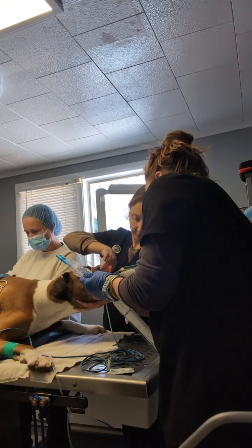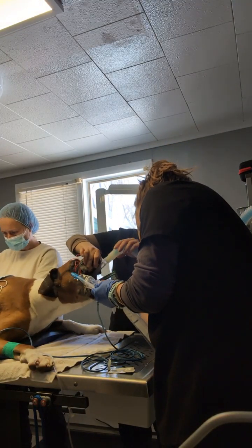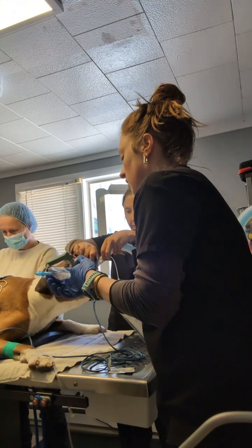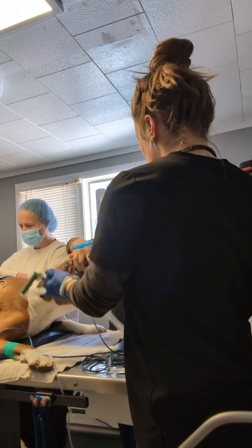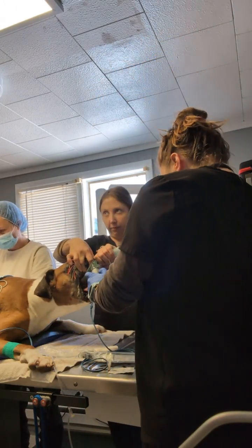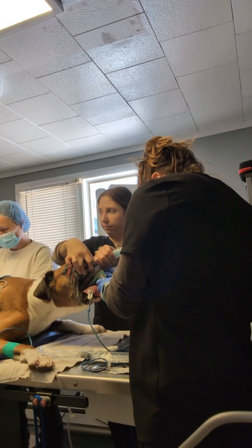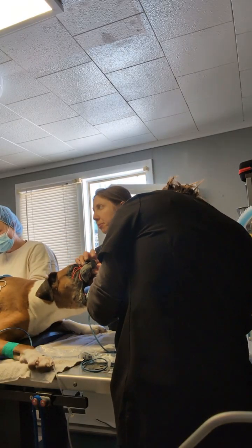Opening up for me. Just going to use the laryngoscope. The esophagus is dorsal to the trachea.